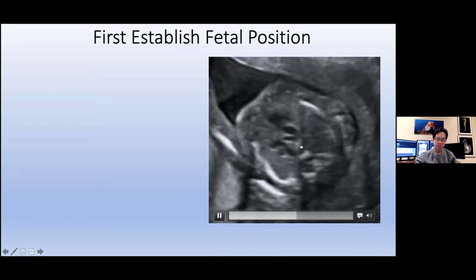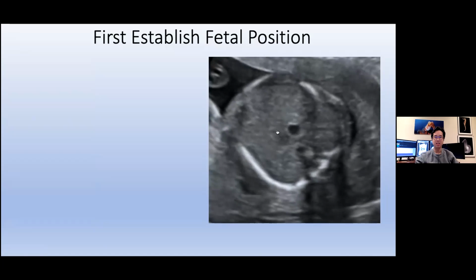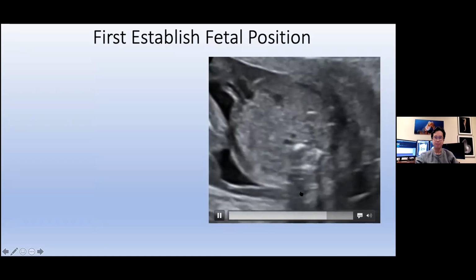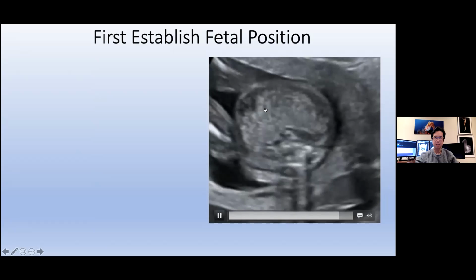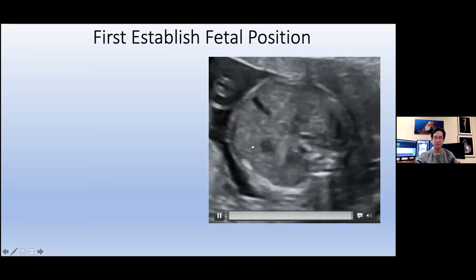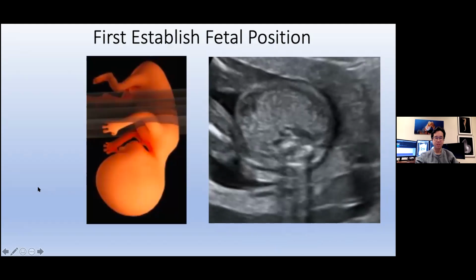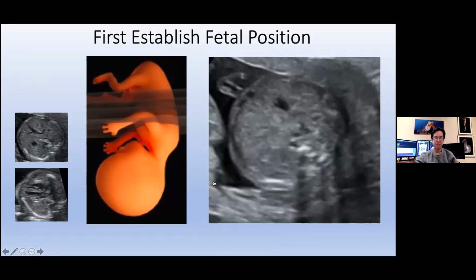Well, your probe is oriented in such a way that the heart is on this side of the image, but this is actually the left side of the fetus. And here is the sweep through. This is the bladder there. Umbilical vein right there. And then there's your stomach right there. So the fetus is upside down relative to your transducer. There's the heart, umbilical vein and stomach, bladder.